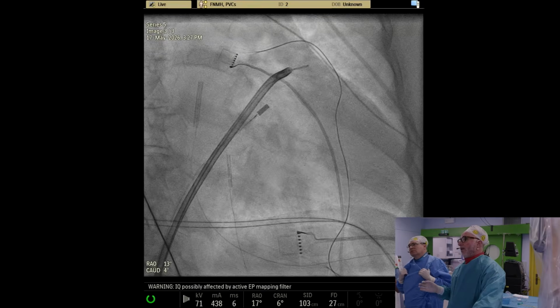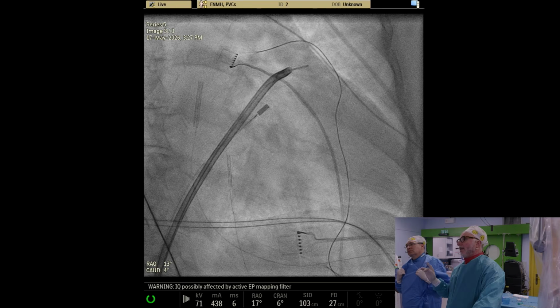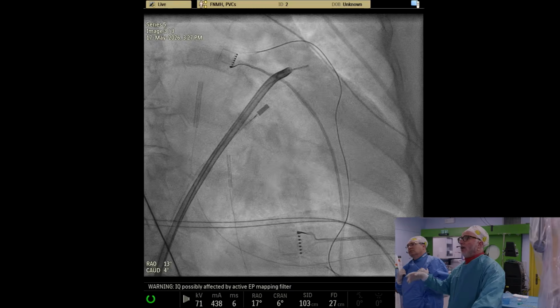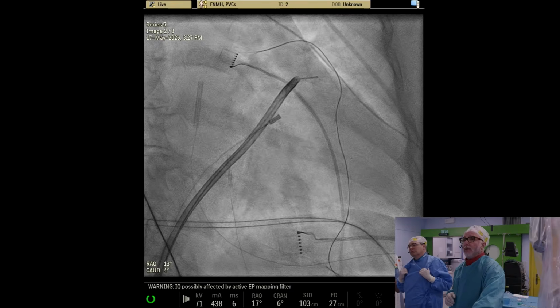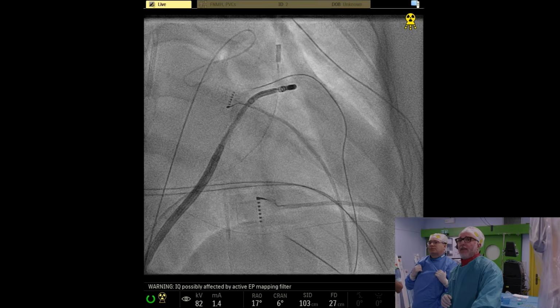Now, for the purpose of this, we said, okay, let's not waste time. We don't have the other catheter. Let's get a good activation map of this vein. So we went in safely, because we have the Agilos there, and put the ablation catheter. We now perform a map. Actually, you can go live if you want, because we repeated it for you to see, okay? This is live right now.